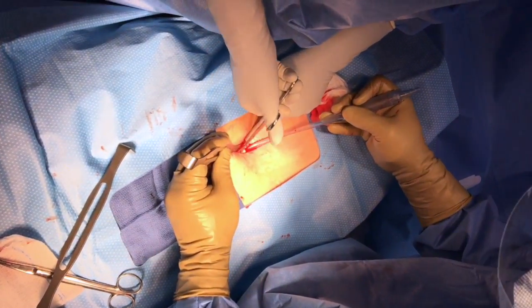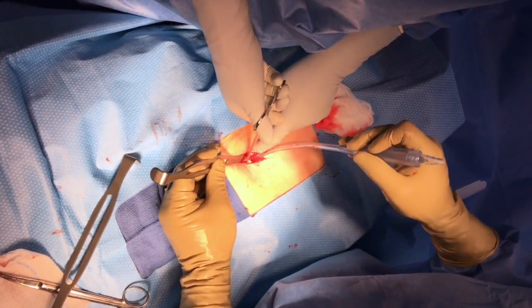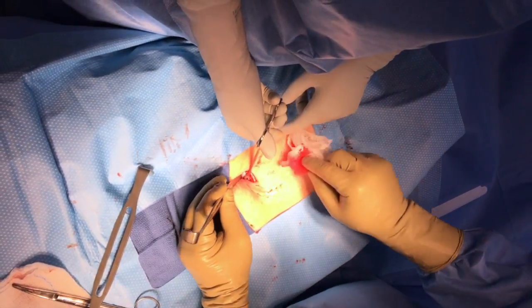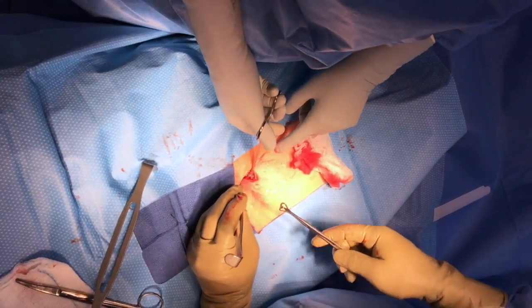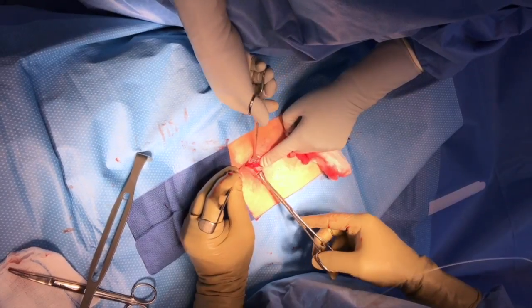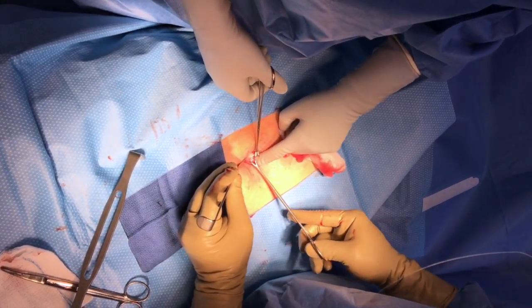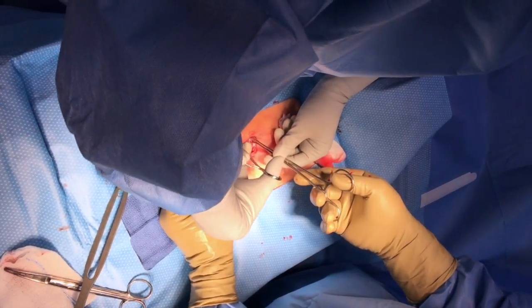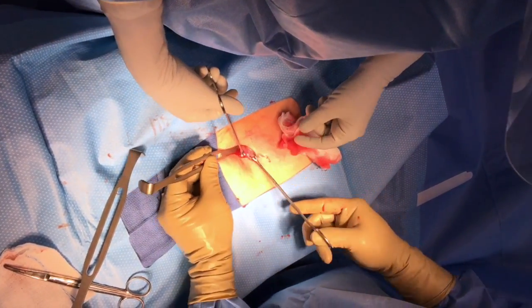Once the tube is visible, grab it and now you can use a second Babcock clamp to make sure that you have the tube. Walk it down to the fimbriated end and then find the portion of the tube that you'd like to interrupt. You have several choices of what you could do with the tube at this point, but first make sure it's the tube.